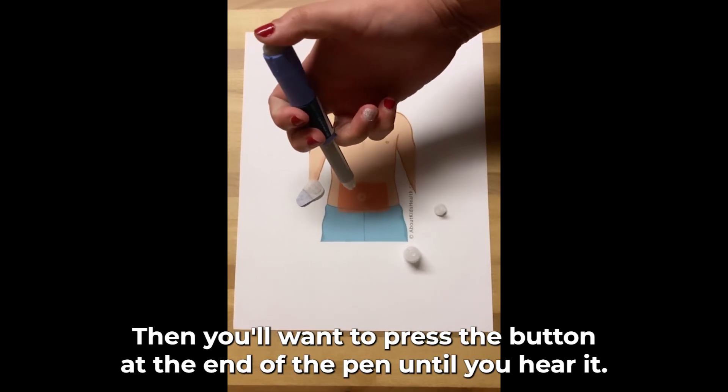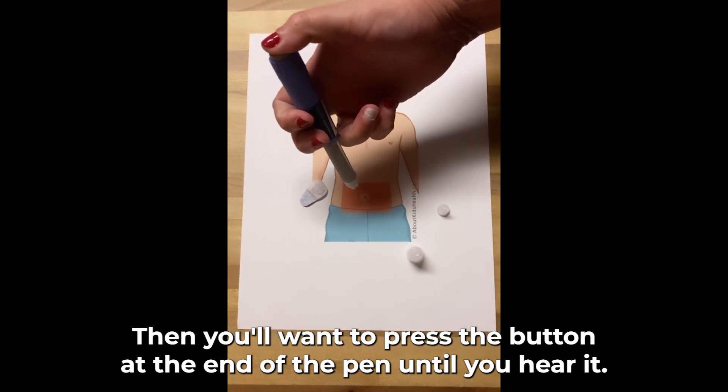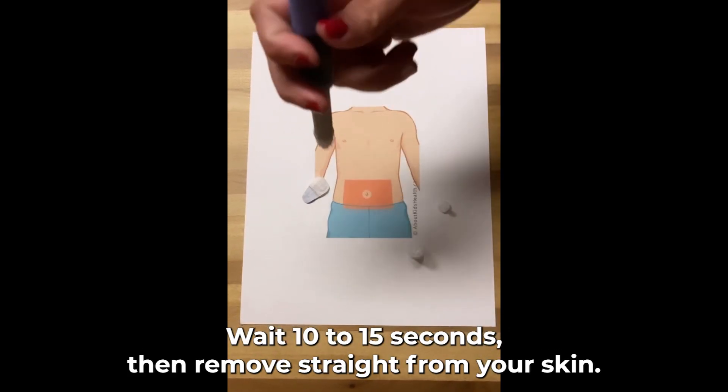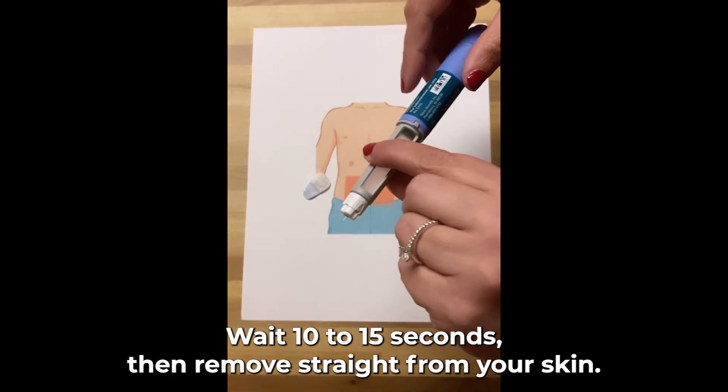Then you'll want to press the button at the end of the pen until you hear it stop clicking. Wait 10 to 15 seconds, then remove straight from your skin.